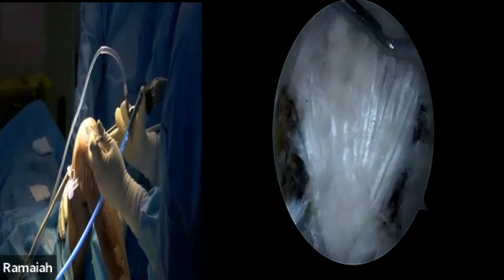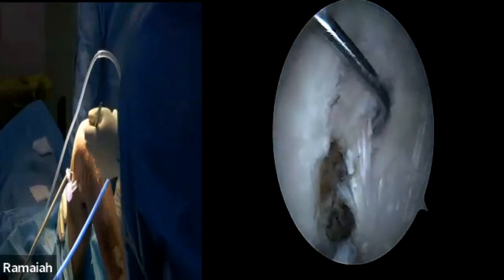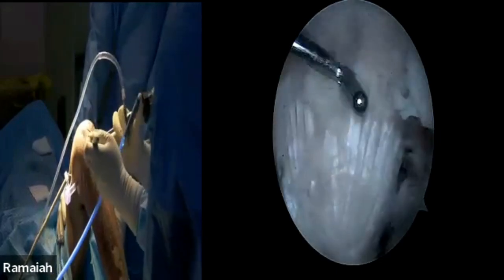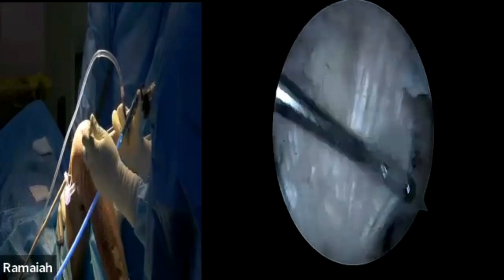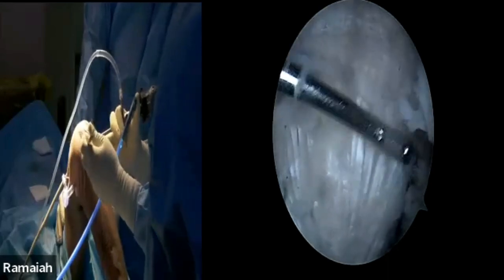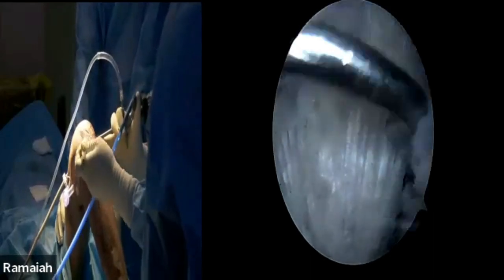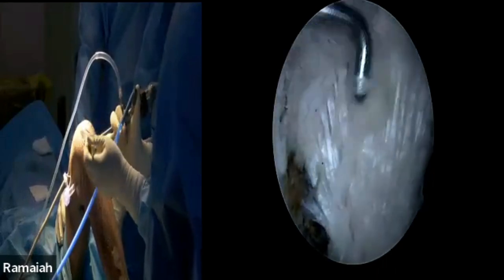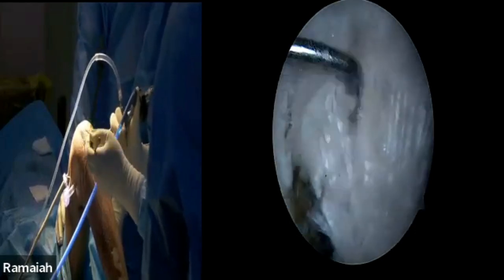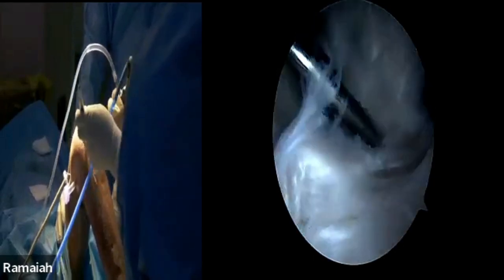Window one is between the medial femoral condyle and the PCL. This fiber is the anterolateral bundle and this is the posteromedial bundle. You can't really differentiate them many times at the junction, but the lower bundles are the posteromedial and this is the anterolateral bundle. As discussed this morning, majority of PCL stability is given by the AL bundle, so in single bundle reconstruction we concentrate on that bundle.